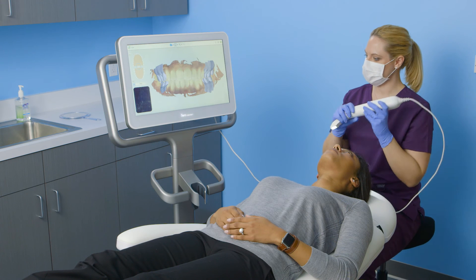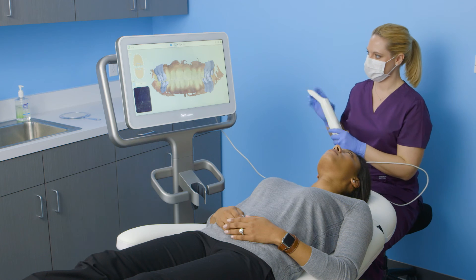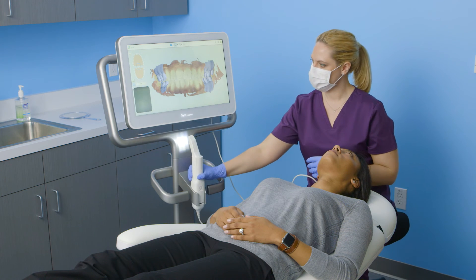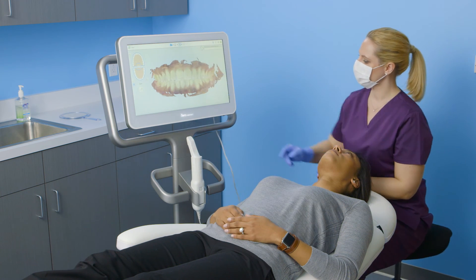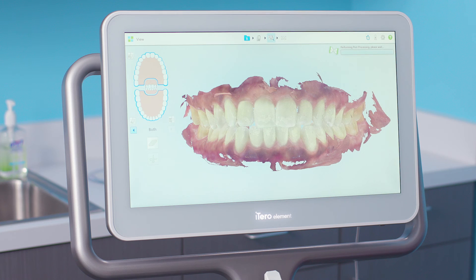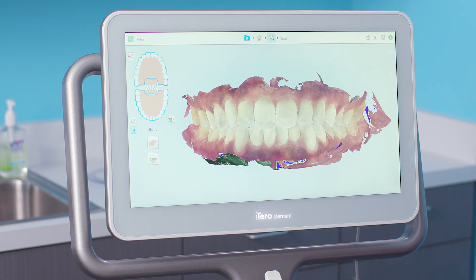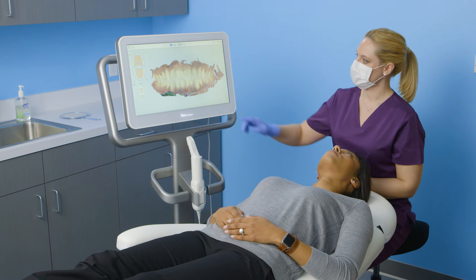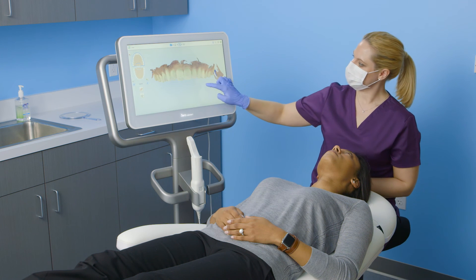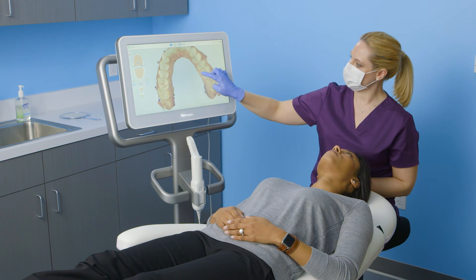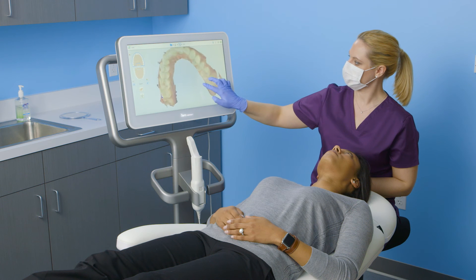Once I've completed the two arches and bite, I'll tap on the view icon at the top of the touch screen display to view my digital model in high resolution. This is a good time to evaluate my model to ensure I've included all the necessary anatomy. At this point, I can add additional scans by going back to scanning mode, or wait for the high resolution model to be ready.